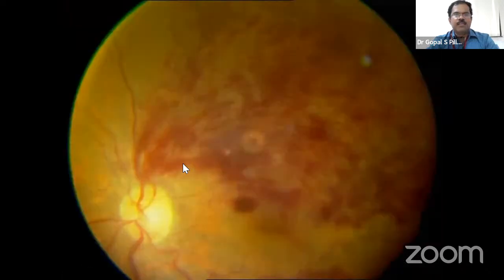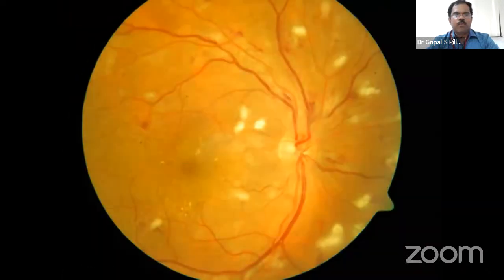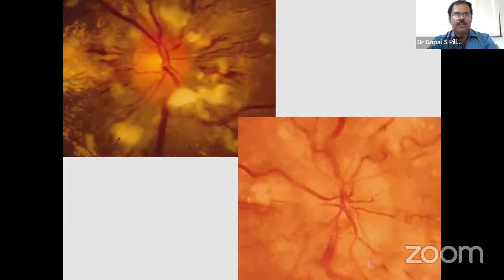Can we ask one of the first years to take? No, why are we moving on? No, let us move to the bleed. Have we got that many photos? Are we going very slowly?